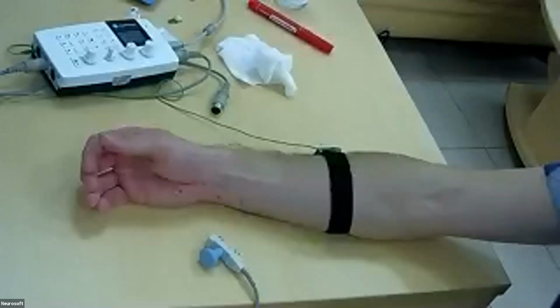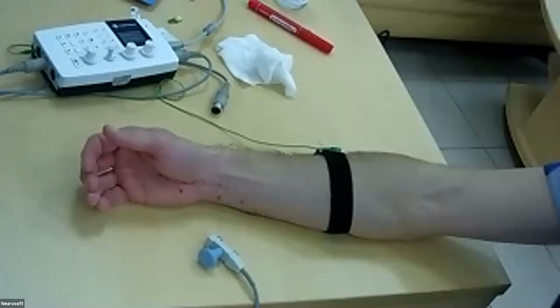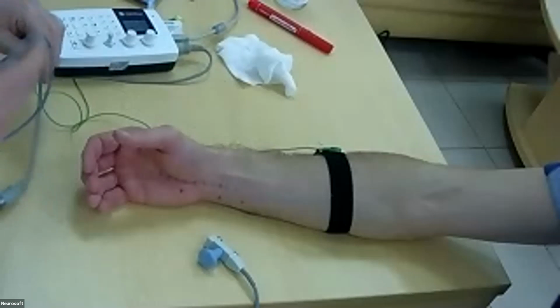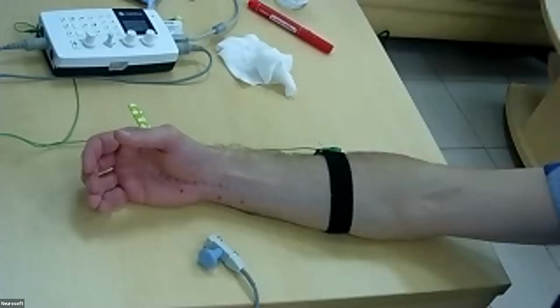So we will set electrodes for abductor pollicis brevis.